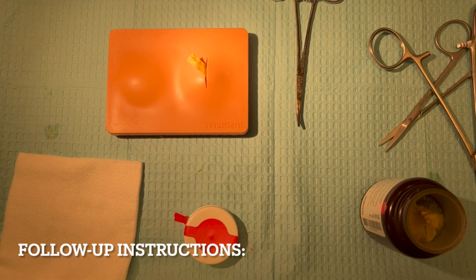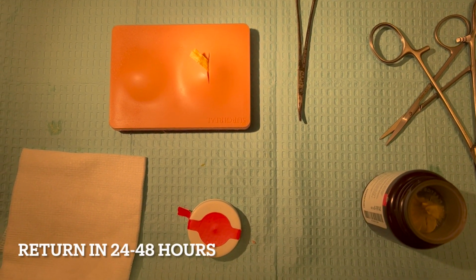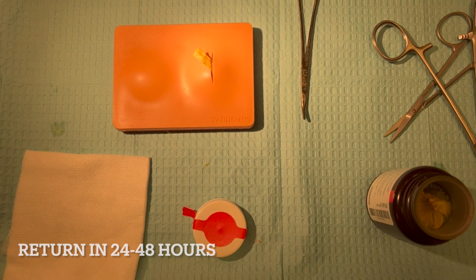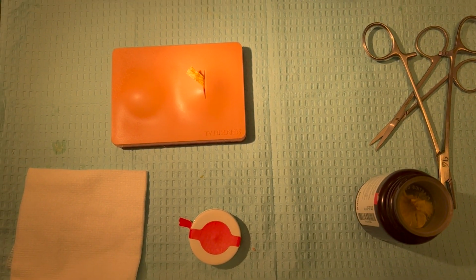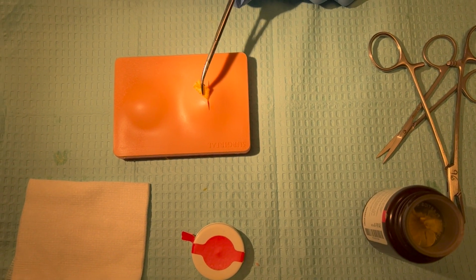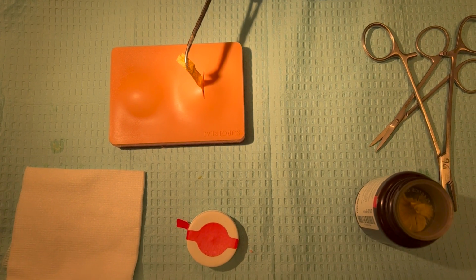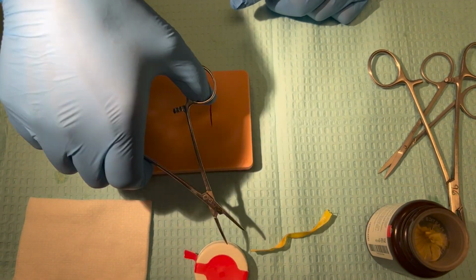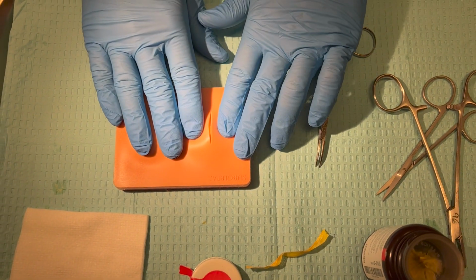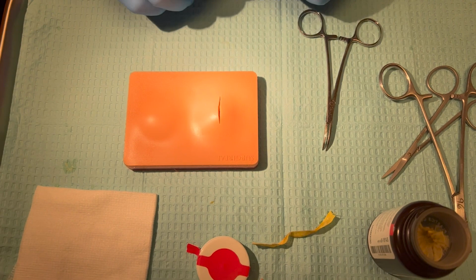In general, follow-up instructions: we want to see the patient back in 24 to 48 hours, especially if we have packed this. When they come back for their follow-up, we'll just use hemostats to grasp that wick, being mindful that this area can still be very sensitive, and we will just pull this out. Once that is pulled out, we'll reprobe the area. If there is no further purulent discharge, then packing does not have to be replaced.